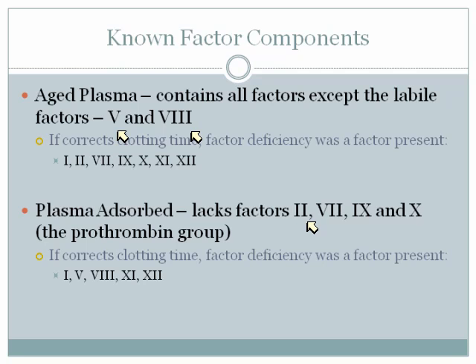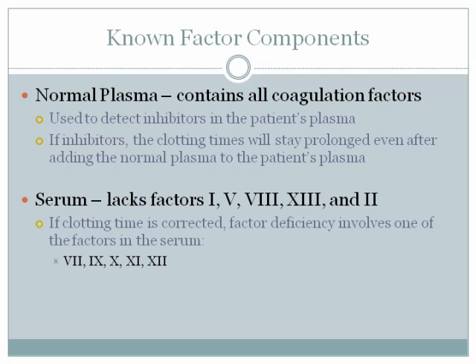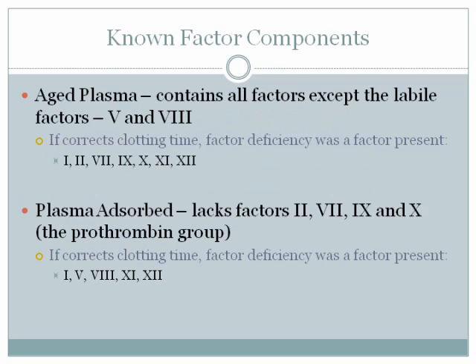So I am going to give you some case study-like questions using these mixing studies so that we can begin to try to solve these together so you can see how these work. On the next slide is a nice little chart that tells you exactly what would be yes or no and what would be replaced. I don't want you to use this because it's kind of like cheating. You're not going to be able to have this on your exam or quiz. I want you to go just by knowing what the serum, aged, and adsorbed plasma contain. So I am going to upload here those questions. Just give me a second to find them.